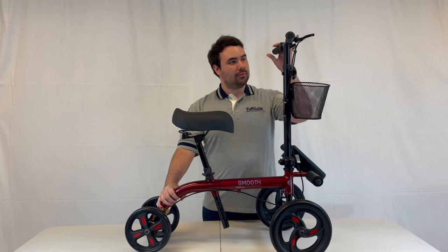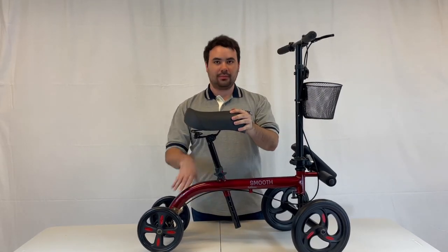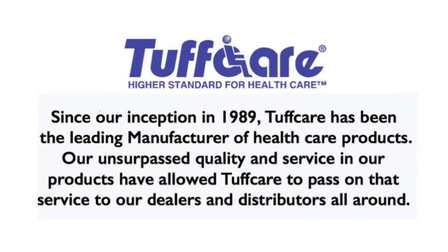Once you have made sure that the seat screws are tightened, your new scooter is now ready to be used. If you have any comments, questions, or concerns, feel free to leave us a note.